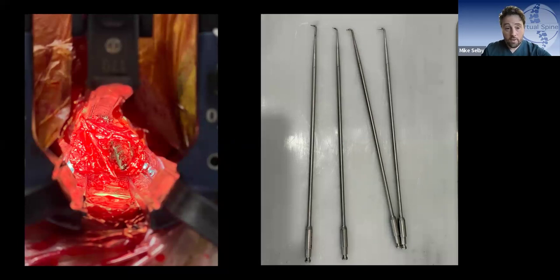And when we pulled this thing out, there was no bone growth through the cage. It was just bone graft substitute still in its almost liquid form within the center of the cage. Now, these bone graft substitutes contain radio-opaque material. So a lot of the time, if the substitute stays within the cage and doesn't reabsorb, it looks like it's fused. It's a mistake that Dan Ryu talks about in the cervical spine a lot, and we also see it in the lumbar spine. You can easily get fooled by these grafts, and you have to know what graft was put in there to know if you can be fooled by it or not.